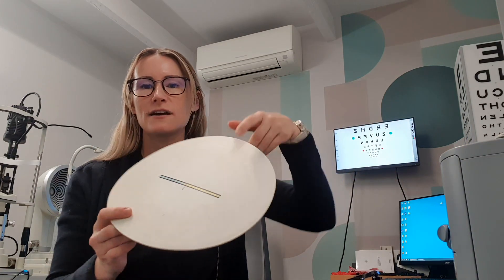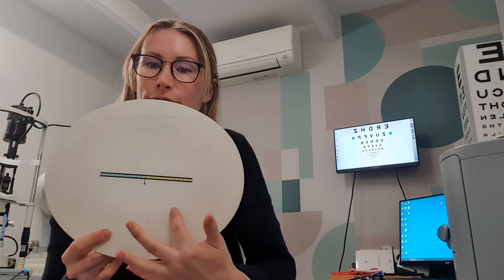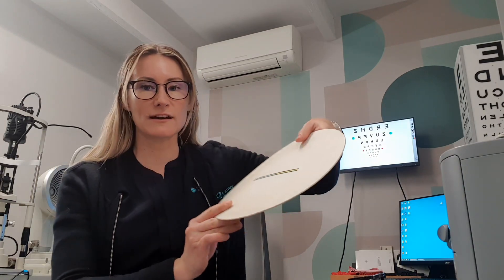We also check the alignment of the eyes, and one of the tests used is the near phoria card. By putting a prism in front of one eye, the child will see two of these images, and the way those two images line up tells us the alignment of the eyes and whether or not the child has to work particularly hard to keep their images in single focus, particularly up close.